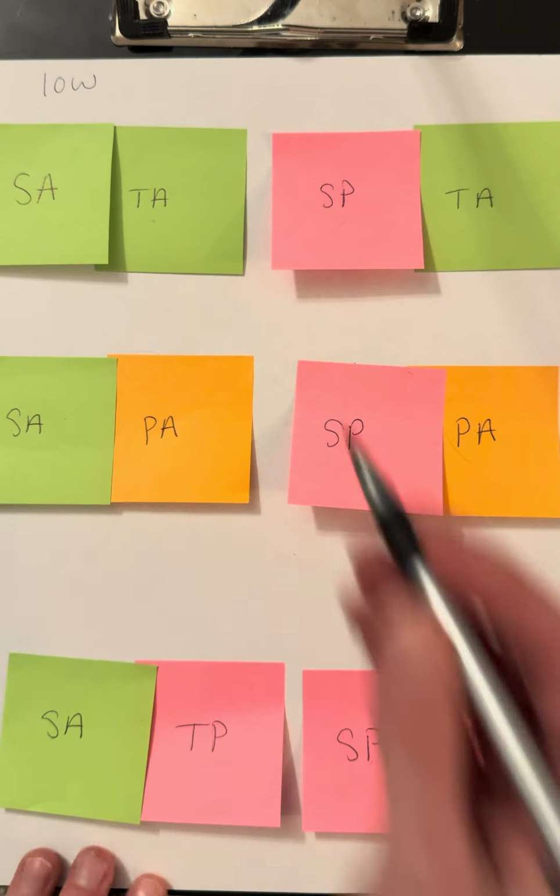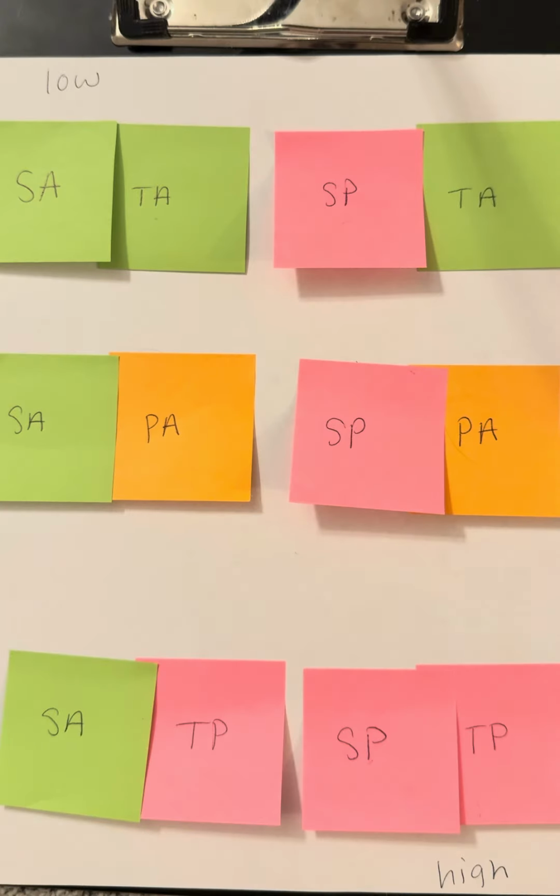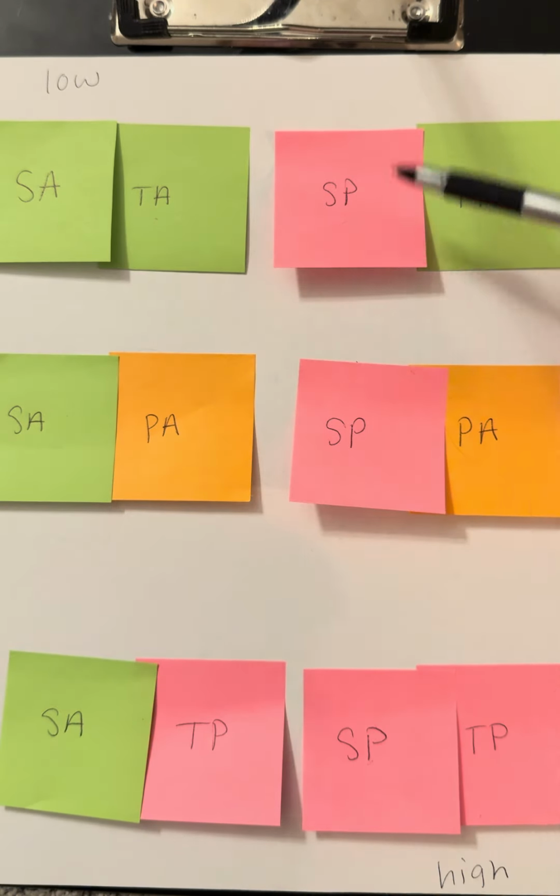If you look at this, spatial average, temporal average is your combo of your two lowest measurements, and then spatial peak, temporal peak is your combo of your highest measurements. So that makes sense, and how they go up in intensity. If you were sorting these the other way, you'd start high and work your way down low.